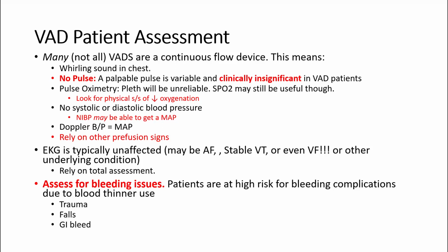We're not really using Dopplers. The moral of this story, and I say this later, so I'm going to say it now, is you're not assessing for a pulse. You're assessing for signs of perfusion. And what does that mean? Look at your perfusion-sensitive organs, i.e. your skin, so capillary refill, and the brain, so you're looking at their mental status. If these things are good, the pump is doing okay, and aggressive intervention is probably not needed.